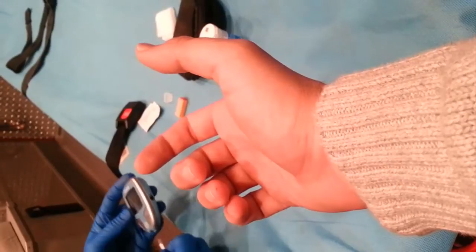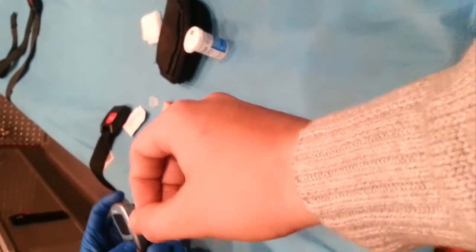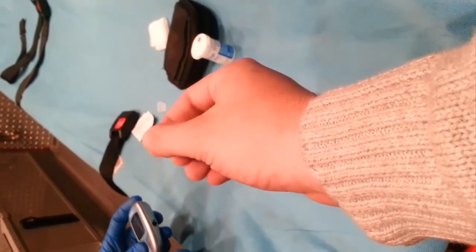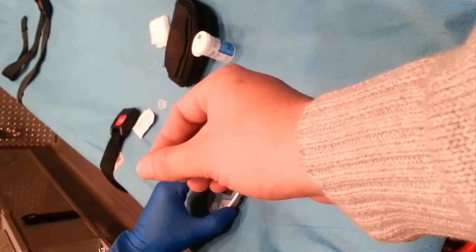Today we're going to be talking about glucometry. It's a pretty basic skill. A lot of our more seasoned providers probably aren't going to want to see this, but we still have some newer providers and students who do need to see it.